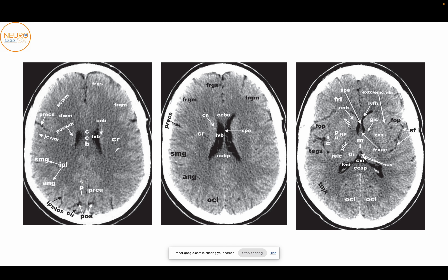As we go further inferiorly, we'll finally start seeing the lateral ventricle. There's a lateral ventricle body, which will be covered superiorly by the corpus callosum body. Laterally to the lateral ventricle, you have the body of the caudate. The centrum semiovale will turn into the corona radiata at this level. You can also see the frontal white matter, superior frontal gyrus, middle frontal gyrus, and the continuation of the inferior parietal lobule with the supramarginal and angular gyrus.